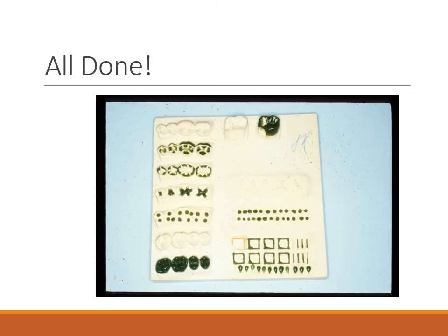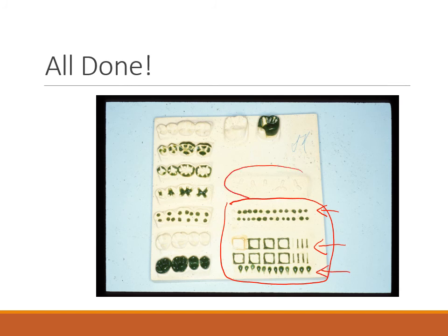So when you're starting your wax block project, you want to start off practicing in this section first. Again, that's going to be cusps and cones, building walls, and pooling wax. This section here is just an example of what you might be able to do with it.